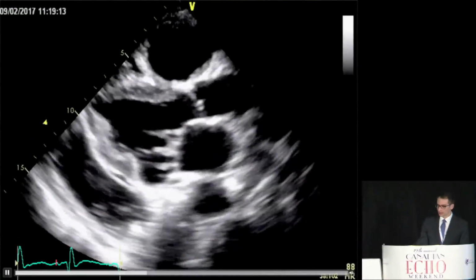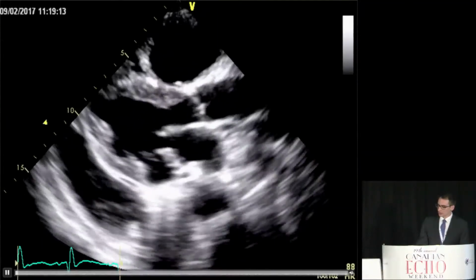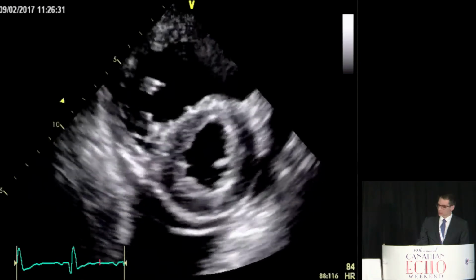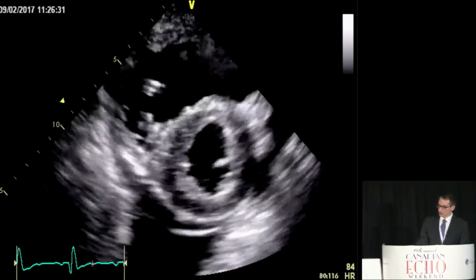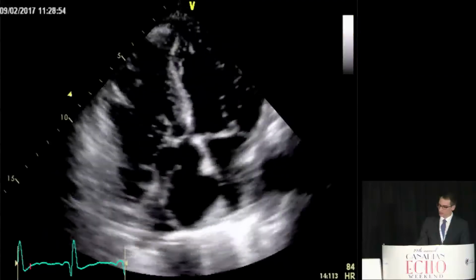So this is from an echocardiogram performed in February of this year. You can appreciate a parasternal long axis view with an enlargement of the RVOT, thickening of the IVS, left ventricular hypokinesia, as well as a left ventricular apical aneurysm. This parasternal short axis view shows flattening of the IVS in both systole and diastole. We can appreciate moderate pulmonary regurgitation here with no evidence of obstruction.